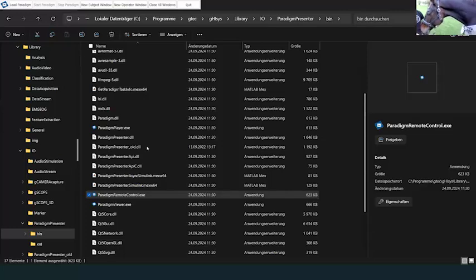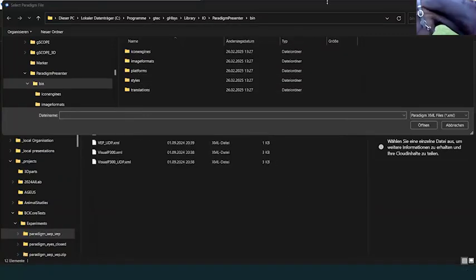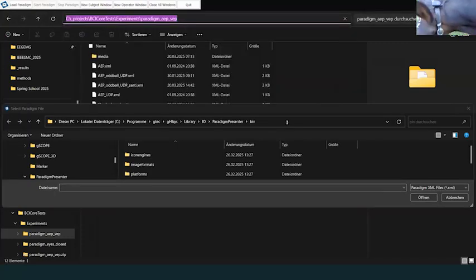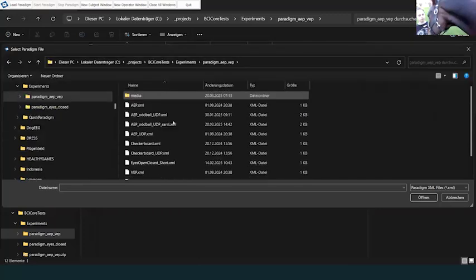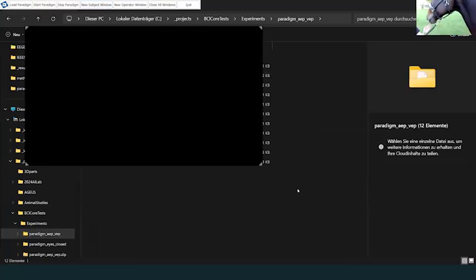And what I also want to show you is the paradigm presenter, so how we perform the experiments. I will just show you shortly now how we can load an auditory paradigm. I'm not sure if you can hear it then also, but I'll just try a standard auditory paradigm that we used last time.